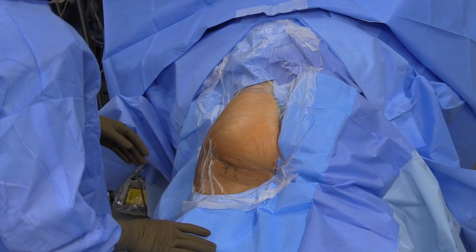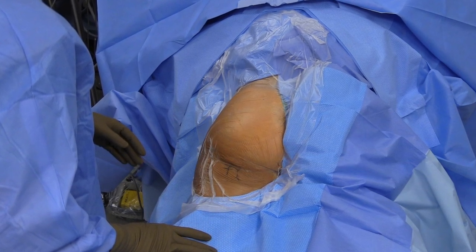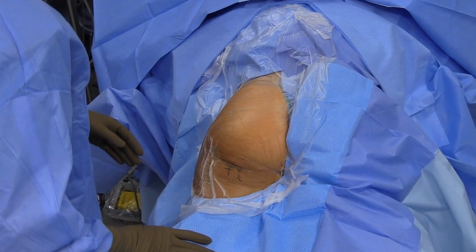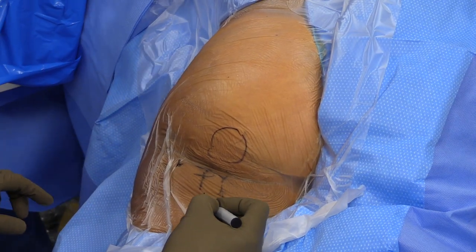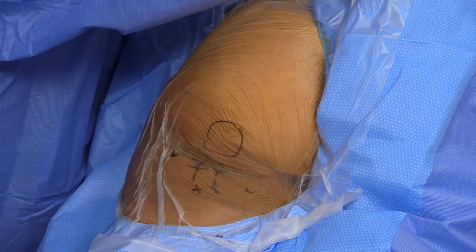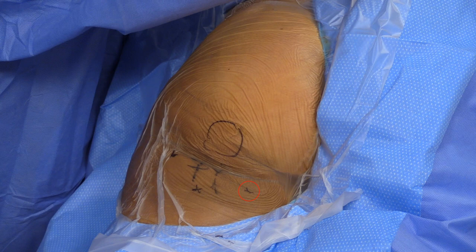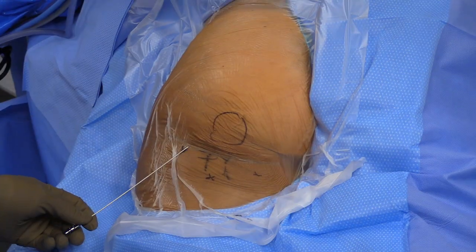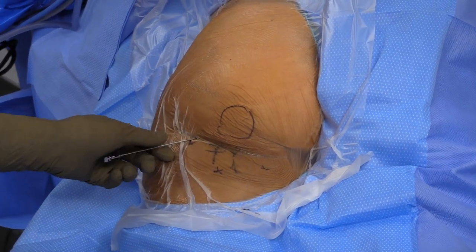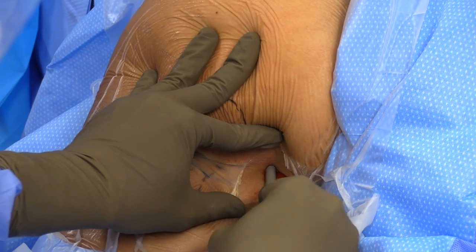A standard operating room table is utilized and the patient is positioned prone. Fluoroscopy enters the surgical field from the contralateral side. The operative extremity is slightly abducted to protect the sciatic nerve. The palpable ischial tuberosity is utilized for portal placement in addition to fluoroscopic visualization. The two portals are marked at approximately 4 cm medial and 2 cm superior for the medial portal, and 4 cm lateral and 2 cm superior for the lateral portal.